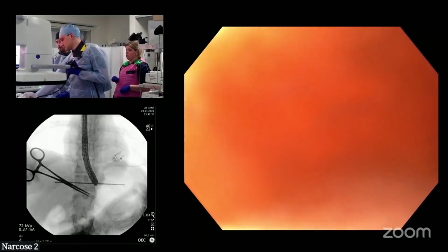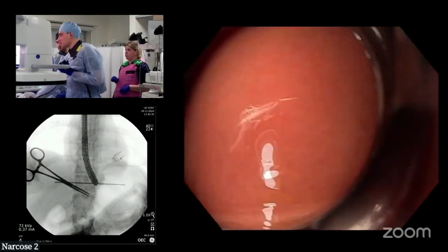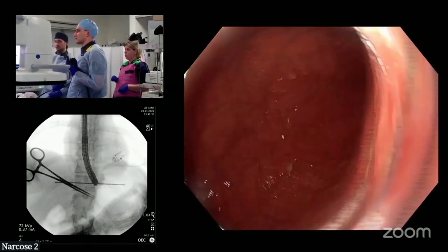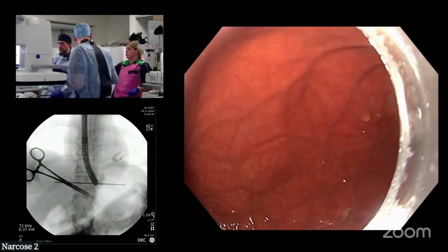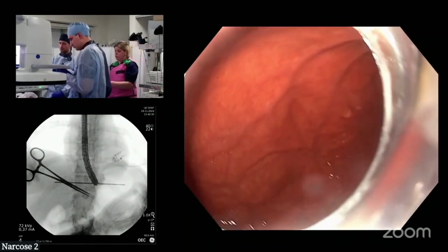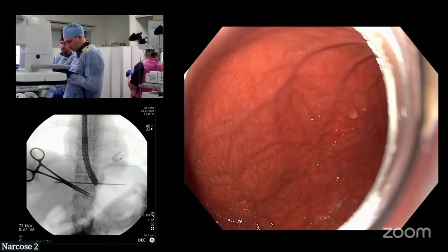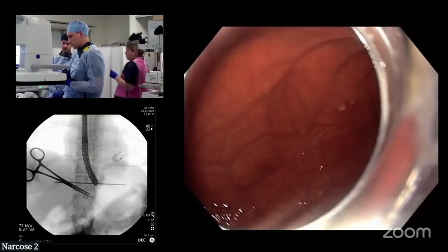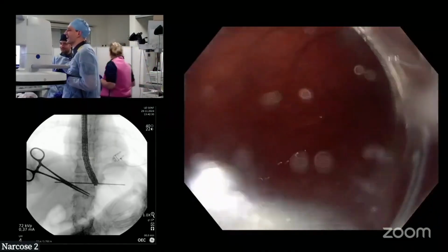The reason why we're using a Savary wire now is because it's reusable, right? Yeah, I think that's one of the reasons. Also, it's relatively stiff, right? The Savary wire, and it's stiff for the balloon. Okay, so we're going to put the wire in, and you got the soft end there. Soft end, yeah, okay. So Michele's got the soft end.